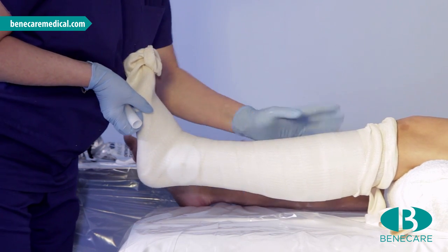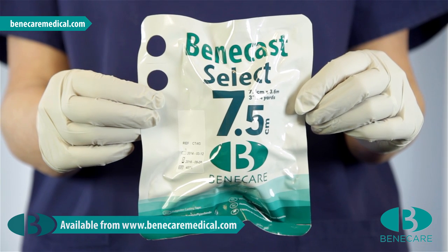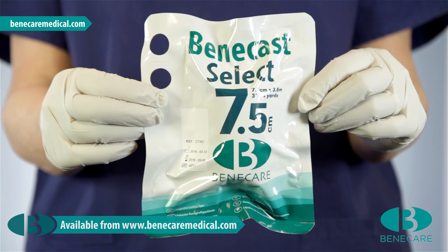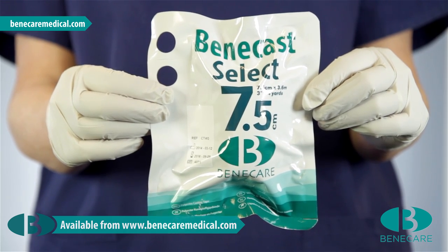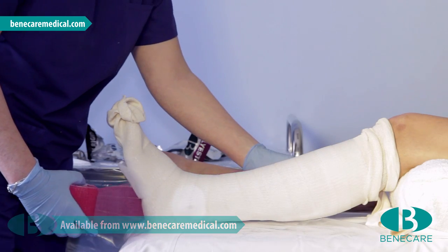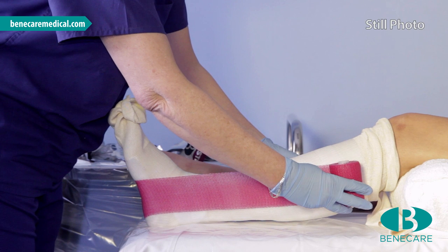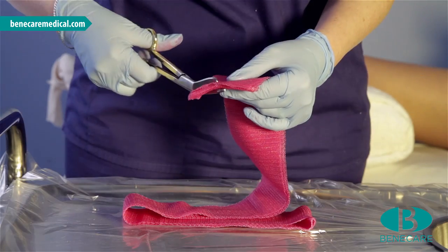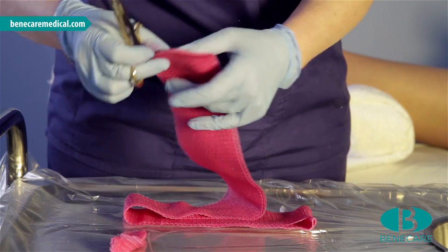Ensure that it laminates nicely. To provide rigidity for the cast, a four-layer slab is required using Benecast Select Polyester. Measure from the proximal tibia on the medial aspect to the proximal fibula on the lateral aspect. Trim each extremity of the splint, removing all square edges.